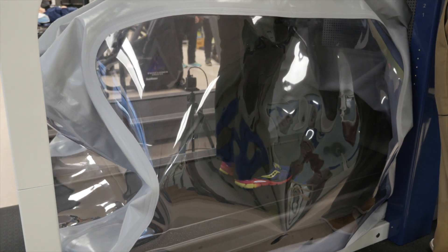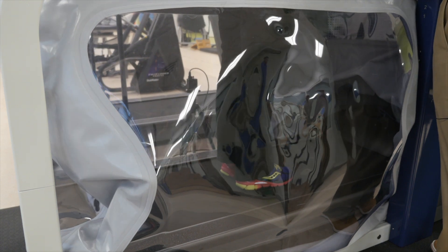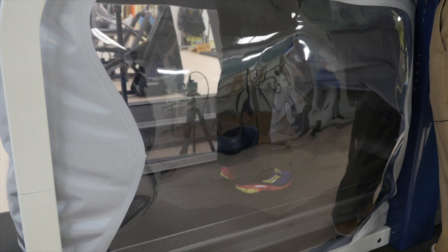Okay, now we're trying to calibrate you. Benefits of the Ultra G are that you're able to rehab a little sooner, and it's also a lot safer because we're able to use objective criteria in terms of progressing patients in their weight-bearing status and returning to run.